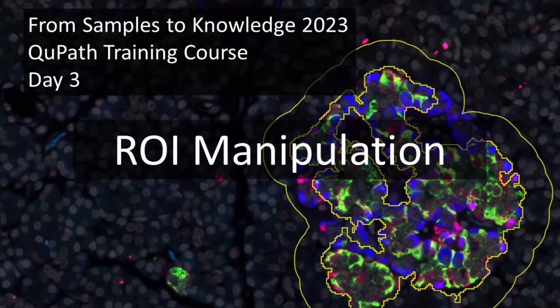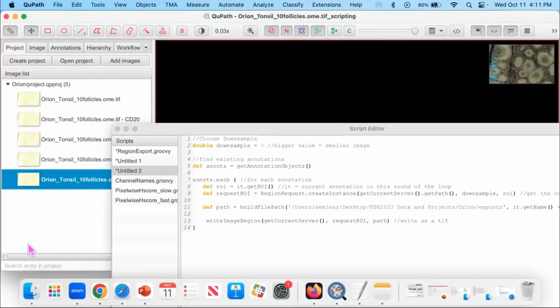So we went through the main ways of making regions of interest to begin with. The common ones are setting a pixel threshold to find your tissue, or you can use a more complicated pixel classifier to find particular regions with certain characteristics. But there are a lot of cases where what you want in a region isn't exactly related to the pixel value. A really common one is tumors.